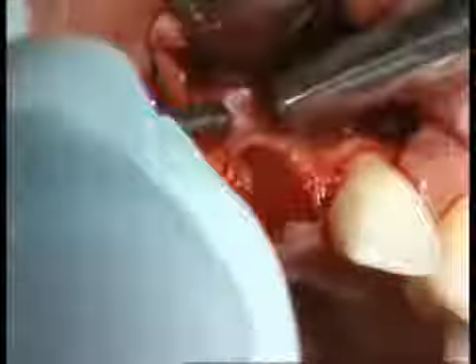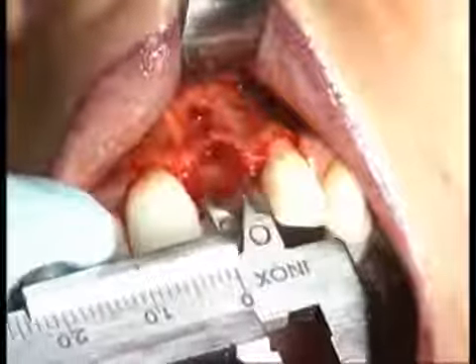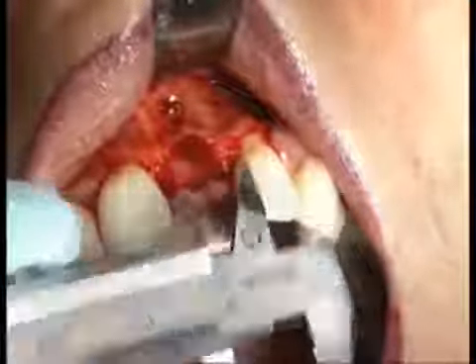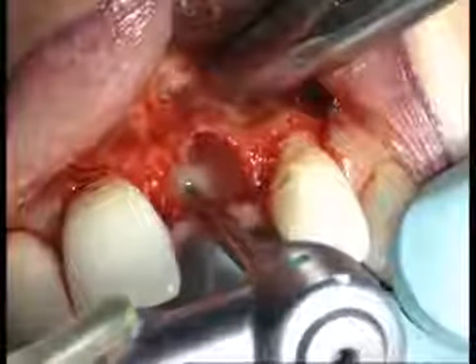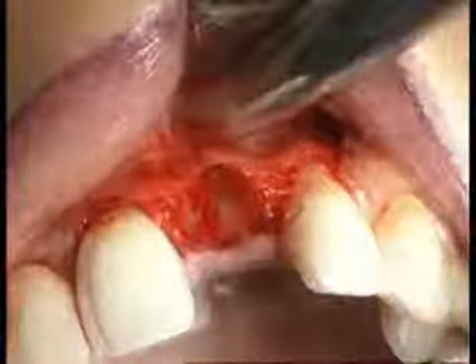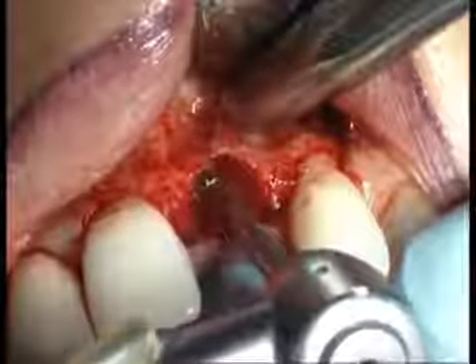The mesiodistal width of the edentulous area is measured using an appropriate gauge. For widths of 9 mm, a Straumann tapered effect implant with a diameter of 4.8 mm is selected. The first round burr marks the ideal position in the palatal wall of the alveolar socket. The second round burr is used for expanding the mark.